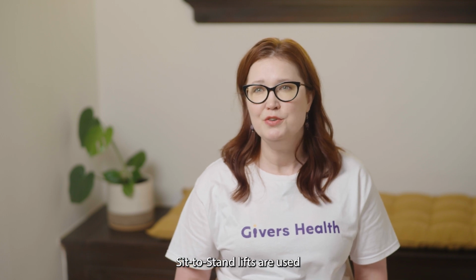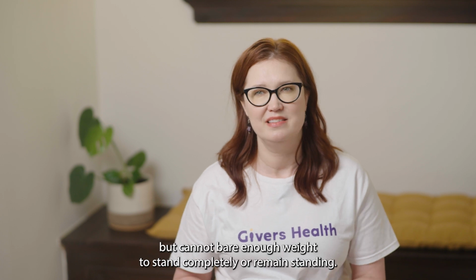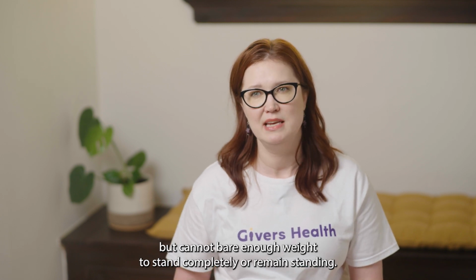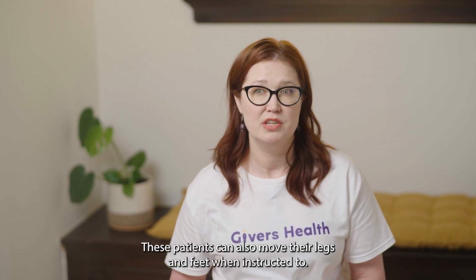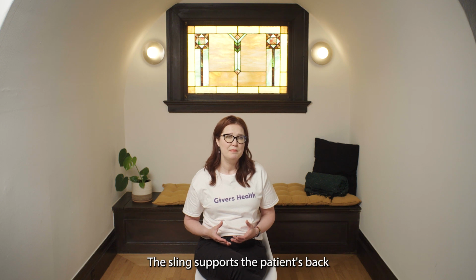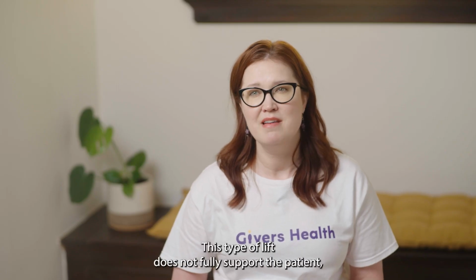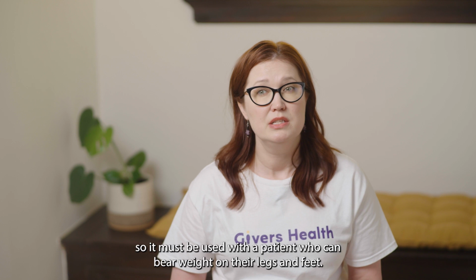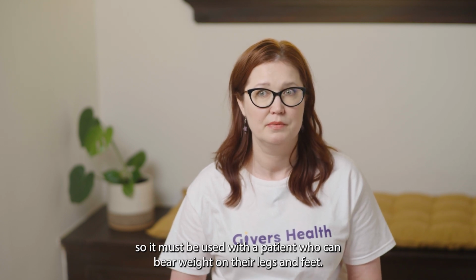Sit-to-stand lifts are used for patients who can assist as you stand them, but cannot bear enough weight to stand completely or remain standing. These patients can also move their legs and feet when instructed to. These lifts use a sling that attaches to the device's arms. The sling supports the patient's back as the lift assists the patient to a standing position. This type of lift does not fully support the patient, so it must be used with a patient who can bear weight on their legs and feet.